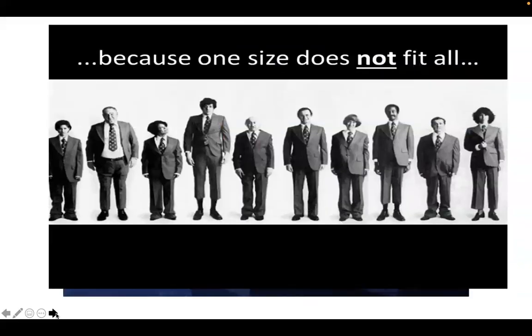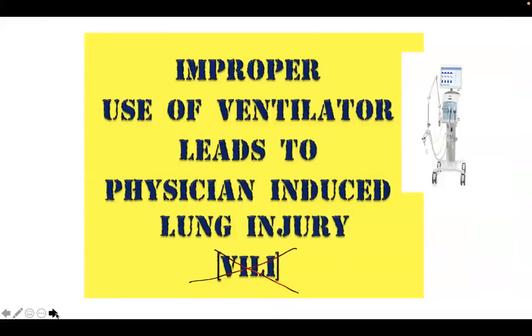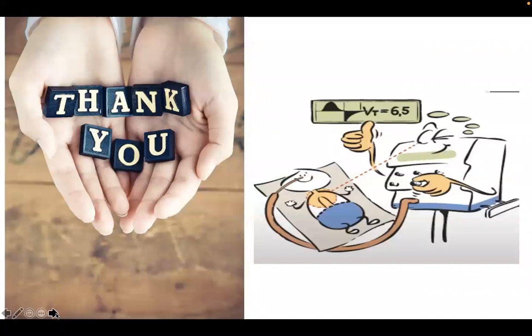We should remember that one size does not fit all, so setting only a fixed tidal volume is not enough. We have to modify it according to the baby's condition. And we should remember that it is not the ventilator, it is the improper use of the ventilator by the physician that leads to lung injury. So it is not the ventilator in this lung injury, rather it is the physician. Thank you.